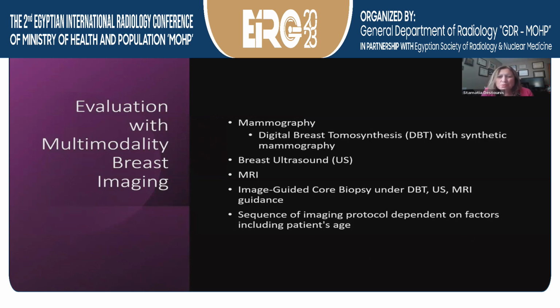Whether you have digital mammography or digital breast tomosynthesis and synthetic mammography, we utilize mammography, whatever exact technology that we have. We also utilize breast ultrasound and breast MRI, and we're able to biopsy whatever lesion we identify, whether on mammography or tomosynthesis or ultrasound or MRI, under the modality that we've identified it.